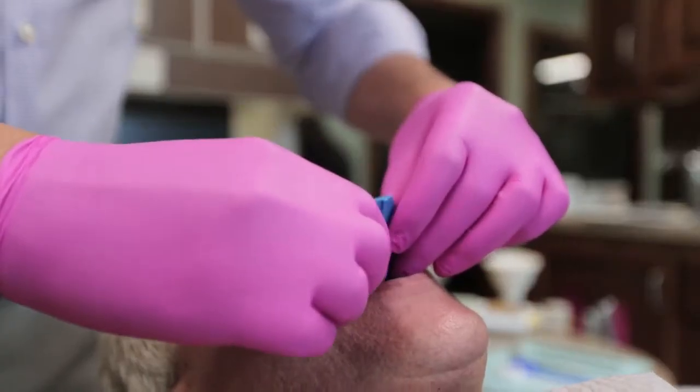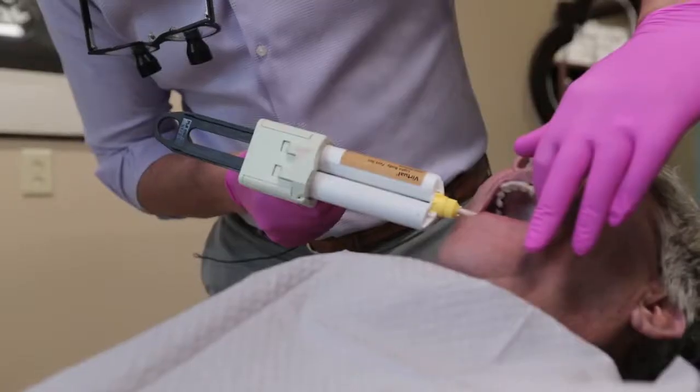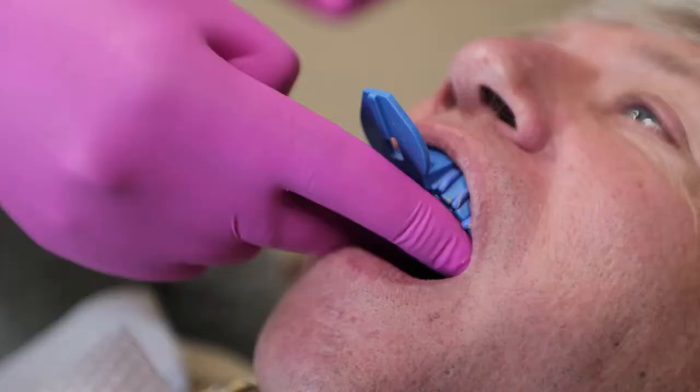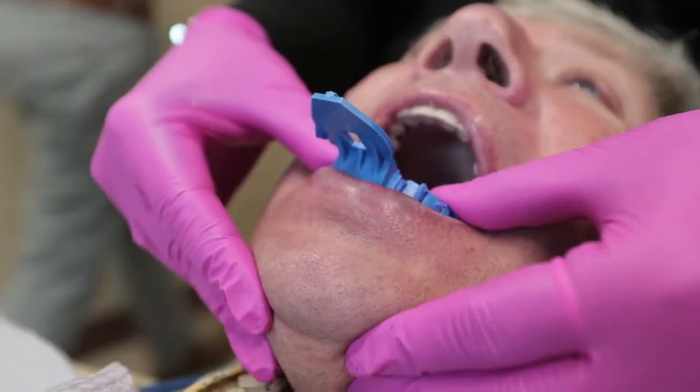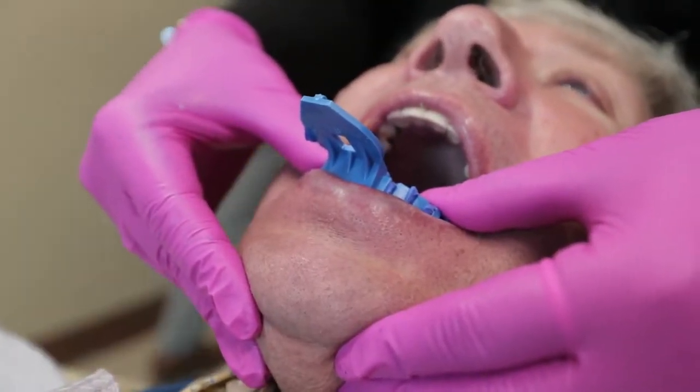You can either make full arch physical impressions. Vinyl polysiloxane is an excellent material — make an upper impression, make a lower impression. You're going to want to make sure you're using a wash material either with a putty, or a wash material with a heavy or medium viscosity material in a tray. Detail is very, very important.